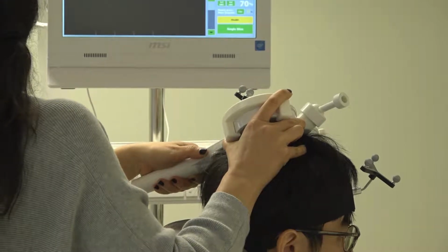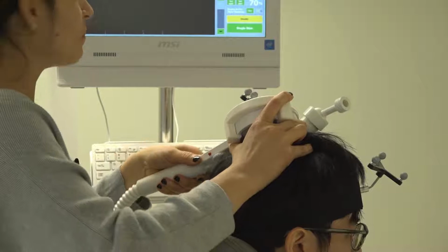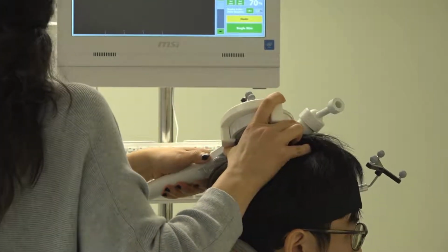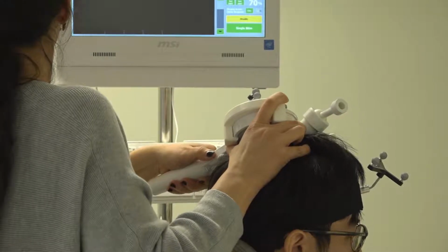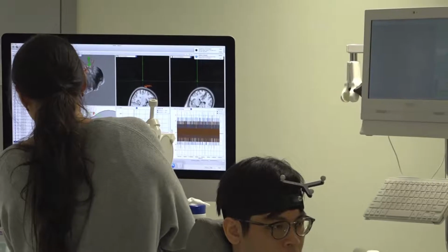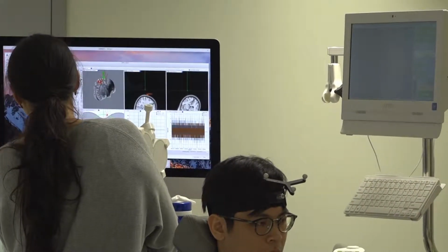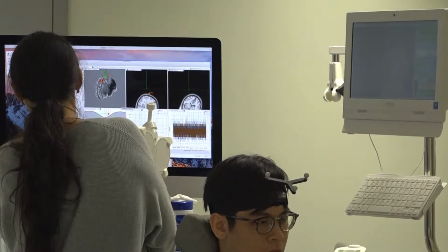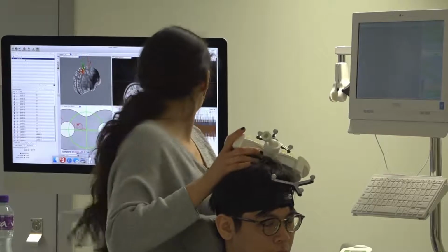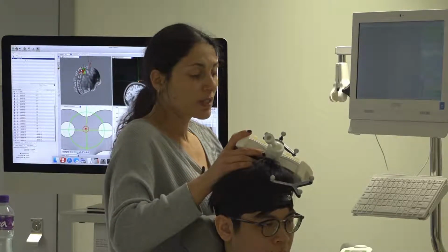But obviously, that's not going to be very successful if I'm looking back and then looking here. Let me try to find it. So it's here. For motor cortex, as I said, you don't need it.